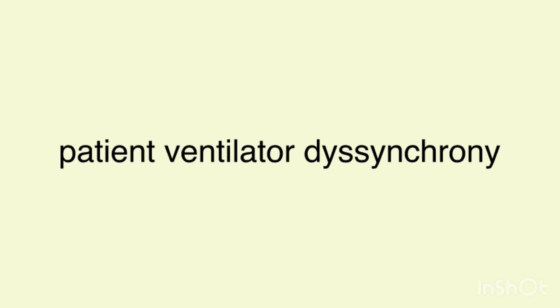Now we are going to discuss pressure support ventilation, or CPAP mode. In pressure support ventilation, we fix a certain amount of airway pressure. So what happens when the patient does inhalation, if their breath is not adequate, is that a negative airway pressure is generated in the tube system. This negative airway pressure generated when the patient inhales will trigger the ventilator. So the ventilator will support that patient breath and provide adequate tidal volumes. This is what happens in pressure support ventilation.